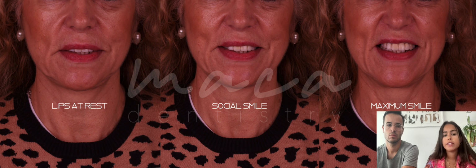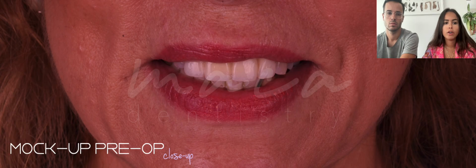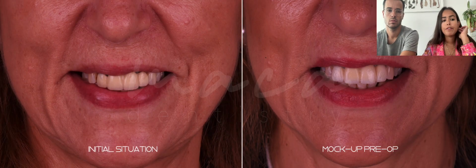Here we can appreciate some extraoral photographs of the patient with a pre-op mock-up. And also a close-up of the mock-up. And finally, the comparison between the initial situation and the mock-up. Both us and the patient were happy at this point with the mock-up, so we proceeded to the surgical plan.